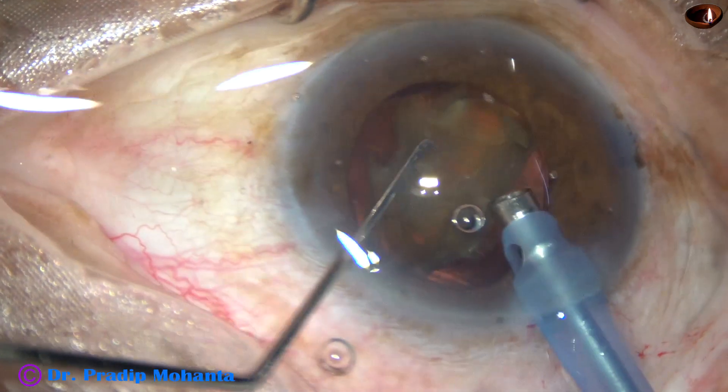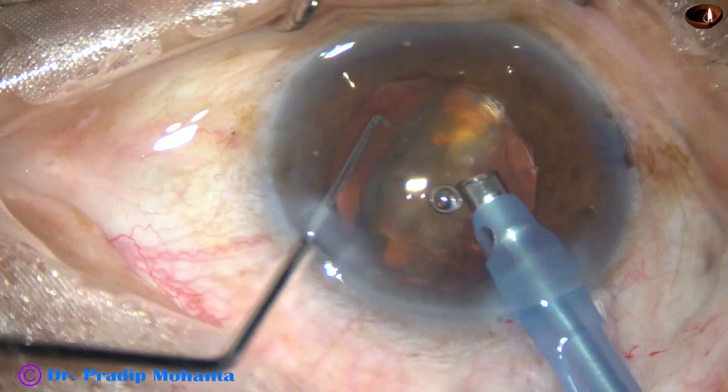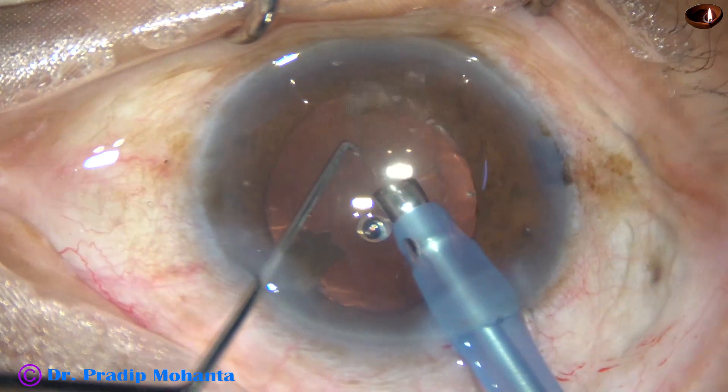Care should be taken to stay away from the corneal endothelium, as well as to keep a little distance away from the lens so that we don't damage the optic of the lens with the ultrasound. It is done.